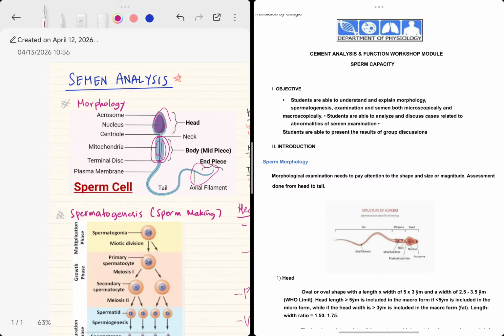Warahmatullahi wabarakatuh. Today I will explain about the semen analysis and sperm function capacity.